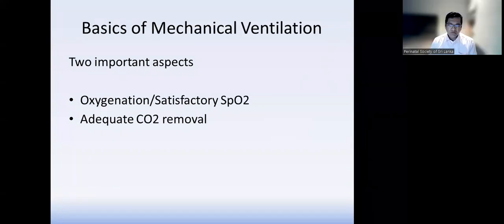So the basics of mechanical ventilation, what is important to remember, I'm doing this in both languages, Russian and English. What is important to remember is that the basics of mechanical ventilation will not change. Whatever the mode of ventilation, the lung physiology, the physiological basis of ventilation, remains the same.